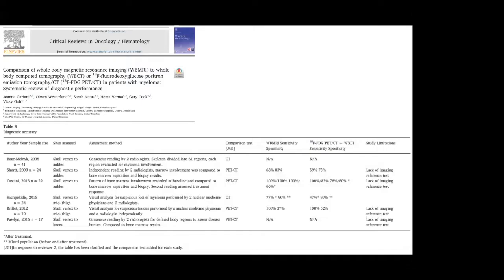Looking at the diagnostic performance, there is one systematic review, which is a bit more critical, despite all the positive news about whole body MRI. And they've included about 6 papers. And as you can see, there's not that much data available. So we've got one study that compared CT to whole body MRI. Sensitivity is much higher for whole body MRI versus PET, and the specificity is quite the same.